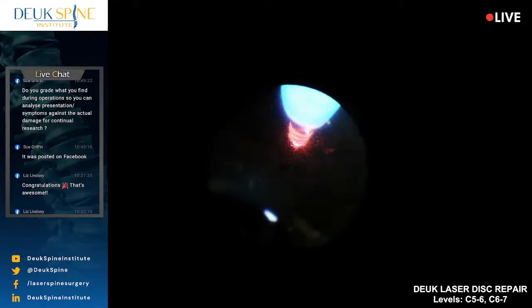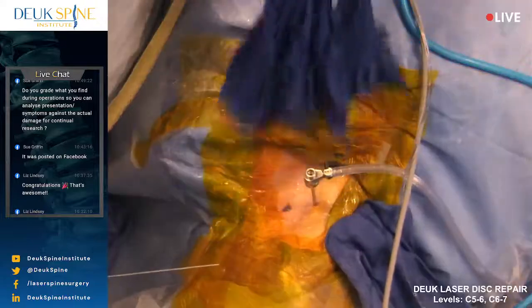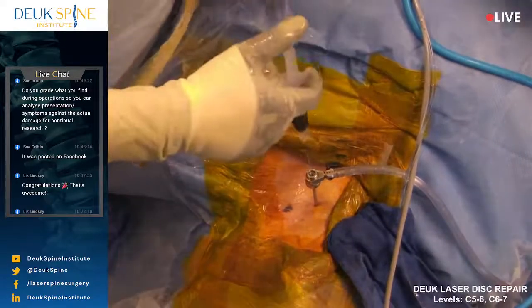We're done. I'm going to show you the whole surgery is done through this tiny little incision. We're going to put a little antiseptic down called betadine.